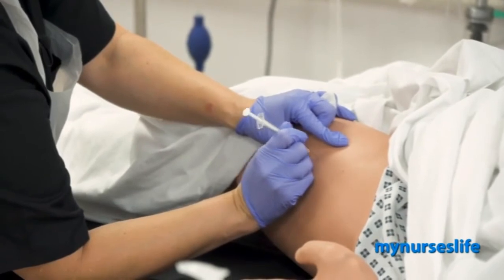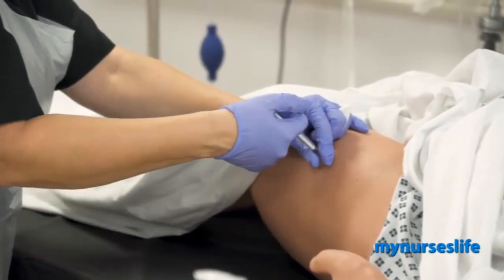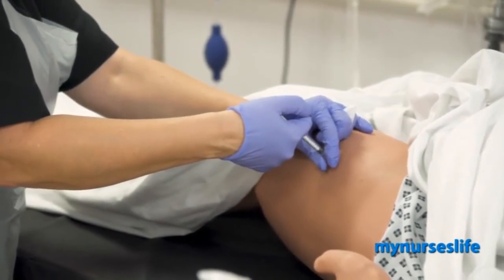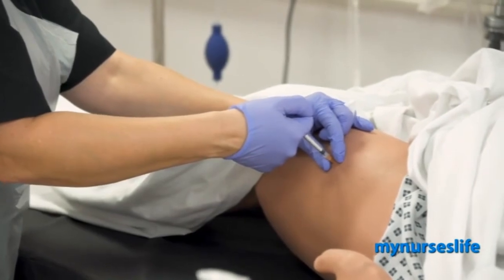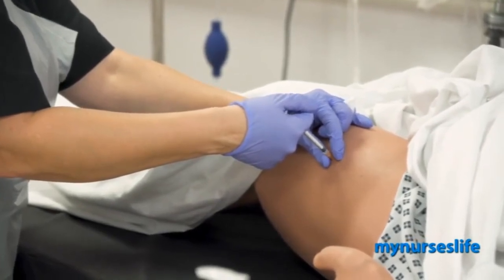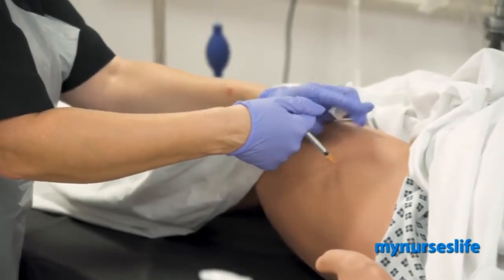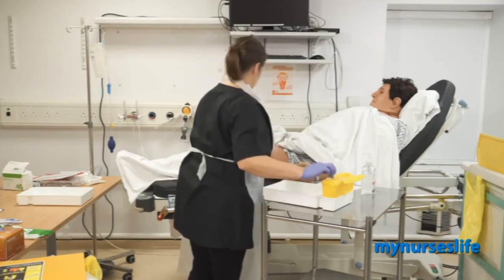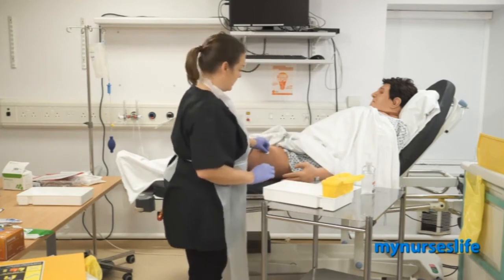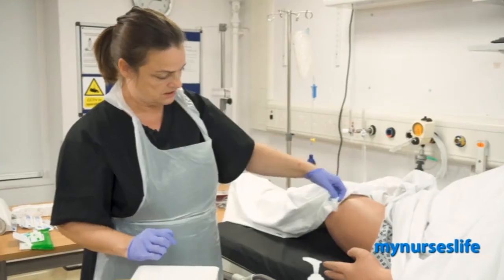1, 2, 3. So I'd give it over 10 to 30 seconds. I'll give it over 15. 1, 2, 3, 4, 5, 6, 7, 8, 9, 10, 11, 12, 13, 14, 15. And I'm going to put it straight into the sharps bin and just press for a second to avoid any leakage. Have a look. There's no leakage.